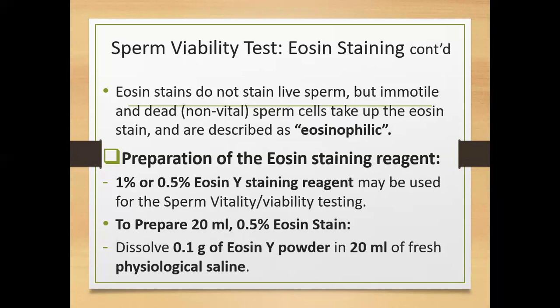Eosin, you normally get eosin Y. I'm sure you know that already. You prepare it as 1% or 0.5%. That is all. A very simple stain. And remember, I said that you can use the eosin raw or use the eosin nigrosin. I'm taking you through the eosin one, and at the appropriate time I will also take you through the eosin nigrosin.